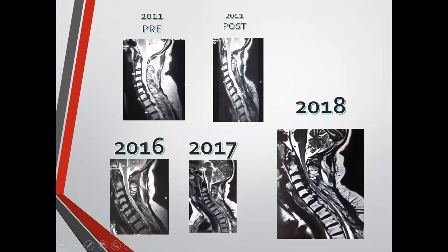You'll remember that OPLL is not a disease which is static. This was a patient who had been operated initially, then decompressed, laminectomy done. Then in 2016, you see the OPLL is progressive in spite of a good decompression. And now in 2018, the patient comes with very extensive OPLL going right down up to the dorsal region. So this is a disease which does not stop with decompression. If you are accepting the theory of instability, then immobilization is mandatory if you are trying to treat OPLL.